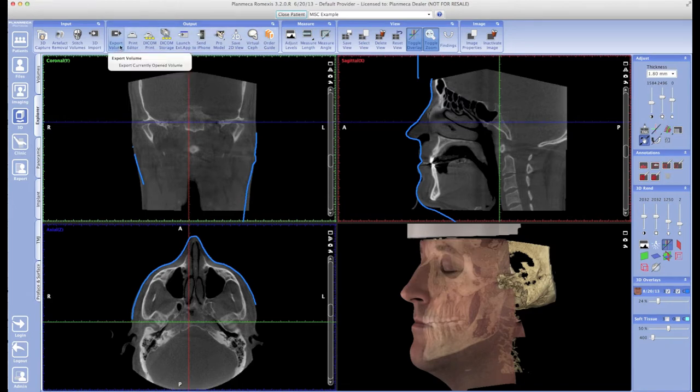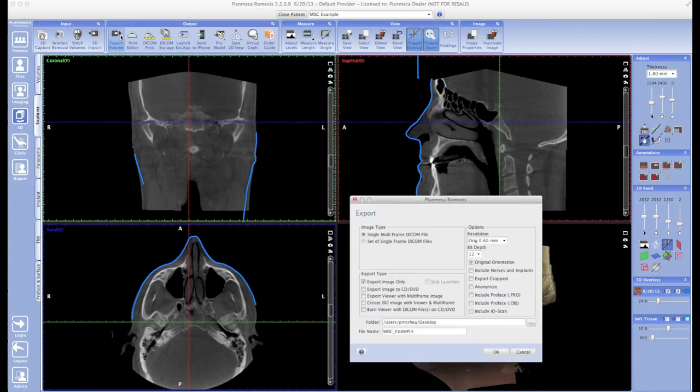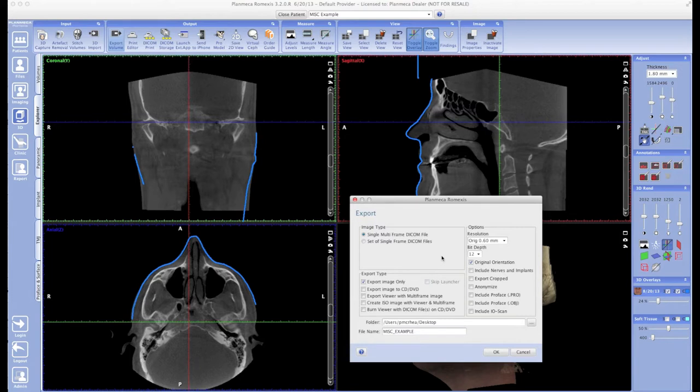This is a very familiar-looking options window, except we have a few more options when it comes to 3D than we did with 2D. For instance, the first option is Export as a Single Multi-Frame DICOM File or a Set of Single Frame DICOM Files. Notice the plurality there—Files is going to literally give you a separate file for every frame in that 3D data set. That's like 400 frames, so you don't really want to choose that.